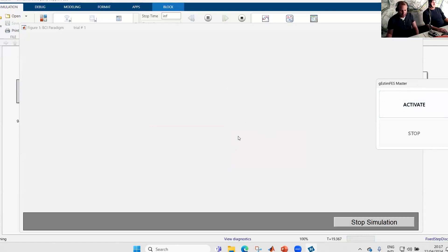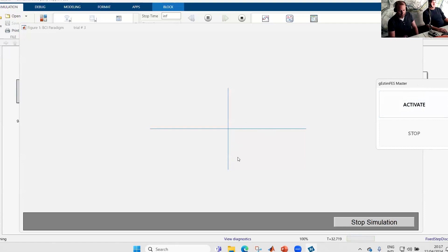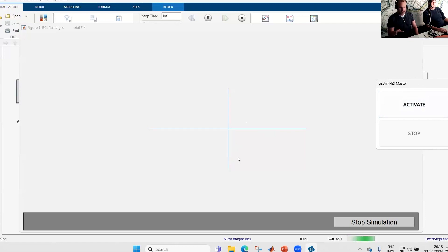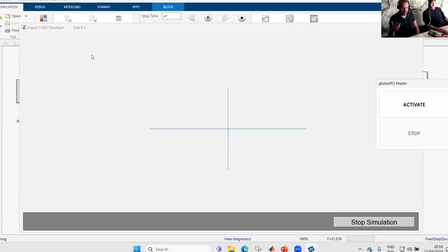Now you see we have this gEstimFES Master. If I really want to get the stimulation, we need to click on the activate button. I won't do it now because I only want to show you the paradigm. In principle, he will see the fixation cross in the middle, then an arrow showing left or right indicating him to start the motor imagery, until the fixation cross disappears. When it's disappearing, he can stop and focus for the next trial. On the top here, we can see the number of trials already done.